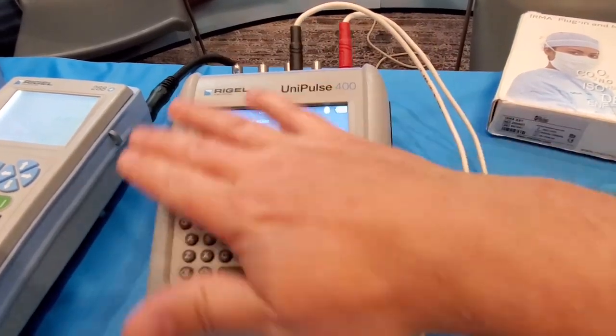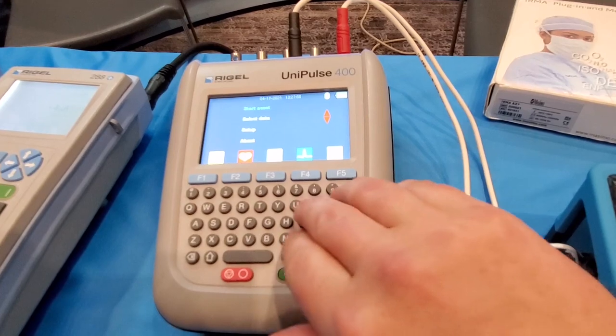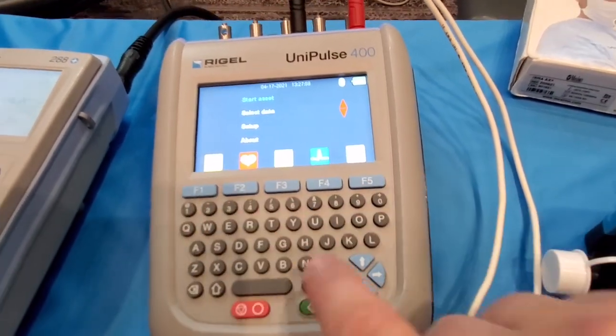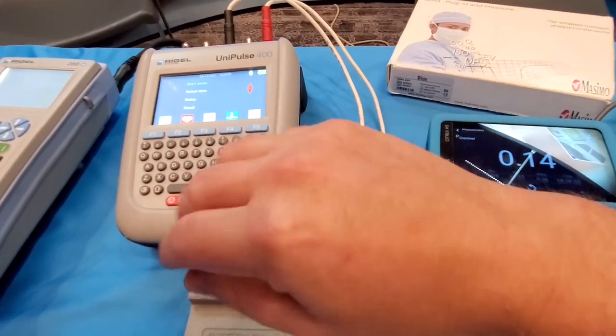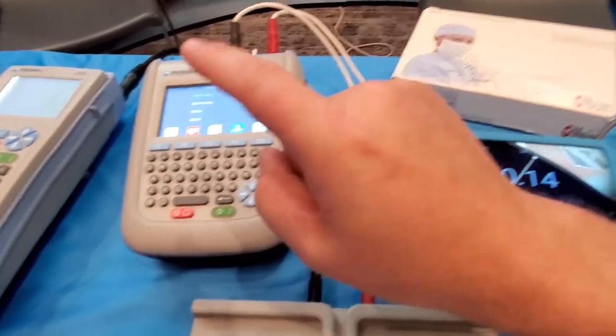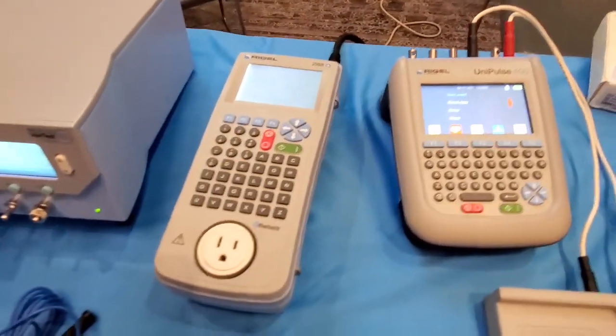The screen is subdued to the surface so it's not going to get damaged if you throw it on its face. Physical keyboard with nice large function buttons for all the different functions — that's the hardest part with a lot of defib analyzers: the layout and the user interface. So far it looks like this one was done right.